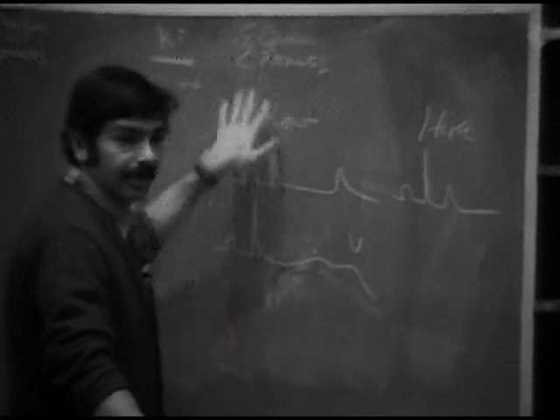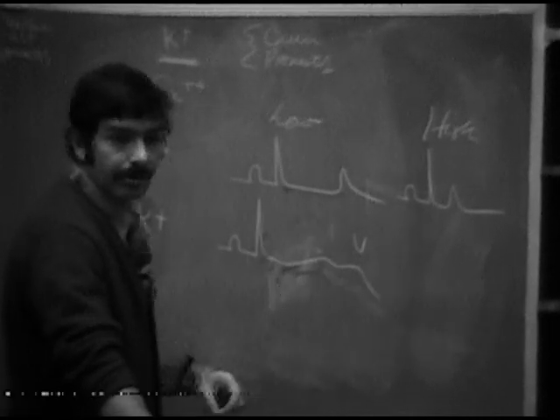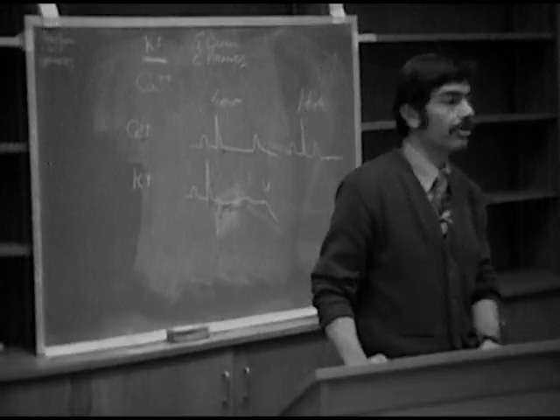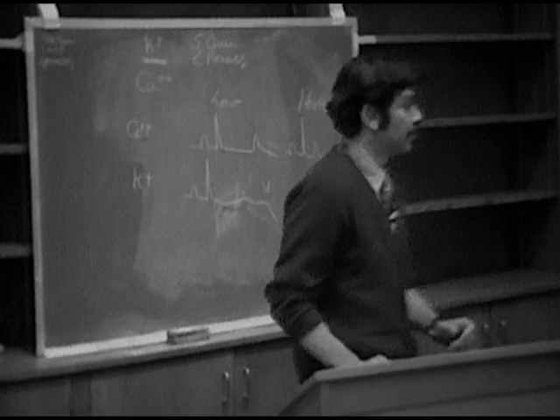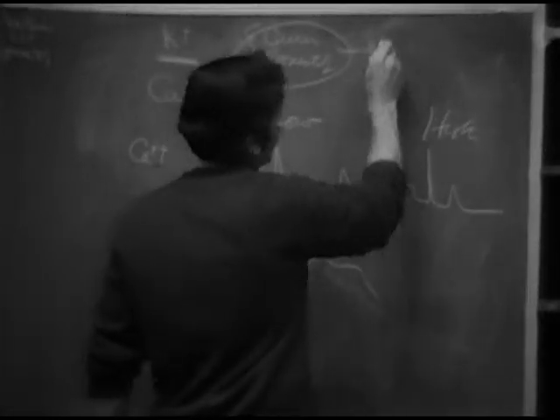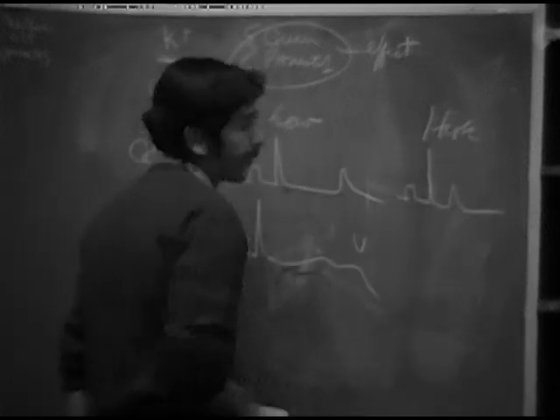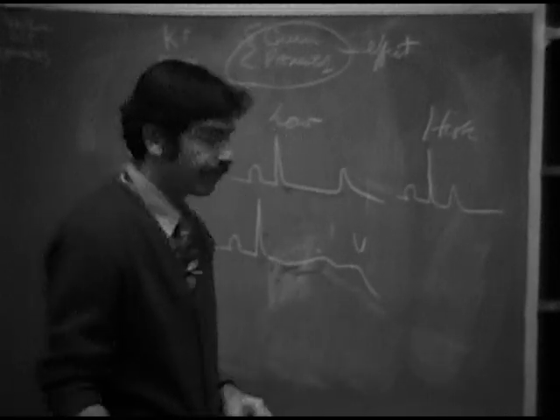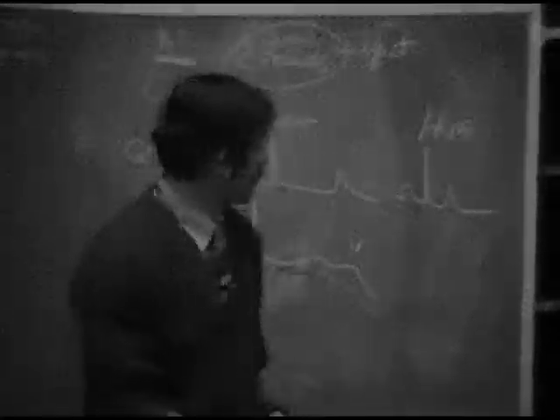So with anyone taking these two drugs, you would have a lot of difficulty in saying whether they do or do not also have hypokalemia. Anybody on a standard maintenance dose of these drugs will frequently have the appearance of hypokalemia on the electrocardiogram.